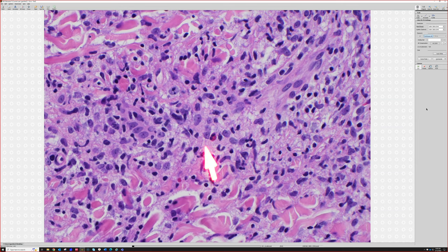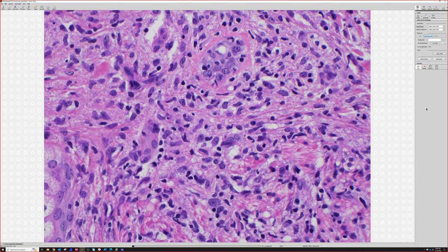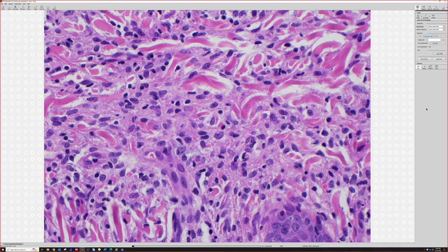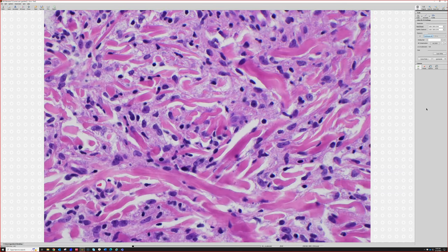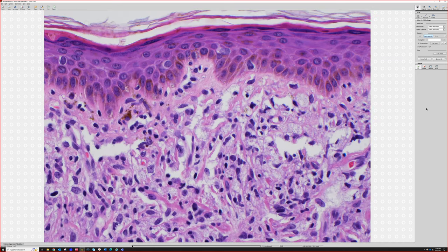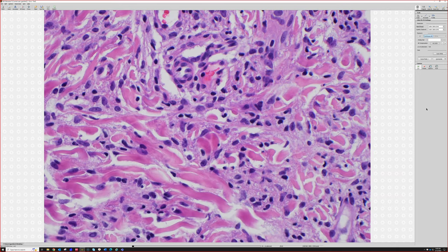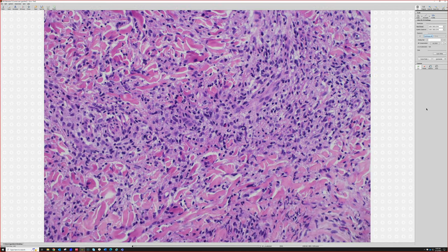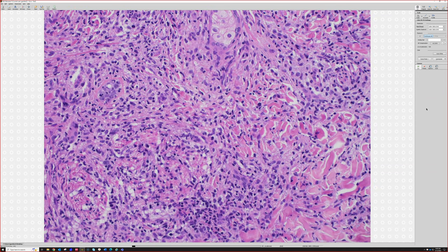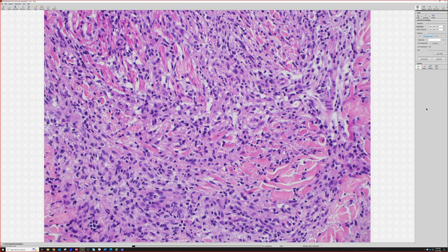We also have occasional eosinophils, and the darker small cells here that are just nuclei, those are lymphocytes mostly. There's a mitosis. Well, that's okay. Inflammatory things can have mitoses too. I think the nuclei look pretty bland. Some of them are kind of large, but they don't look markedly atypical to me. And this was a solitary papule on the face of a child, probably, but I don't know for sure. And there's more EOs. So foamy histiocytes in sheets in the dermis with scattered EOs and some lymphs and a little bit of spindled fibroblasts and fibrotic collagen in the background.